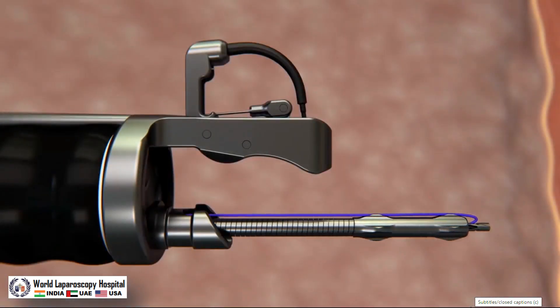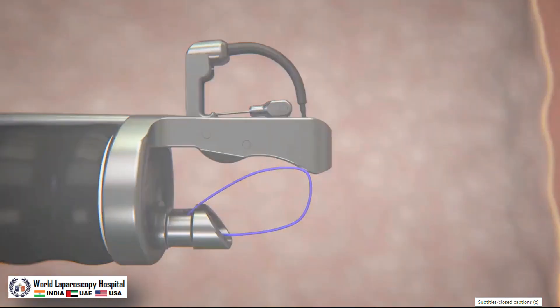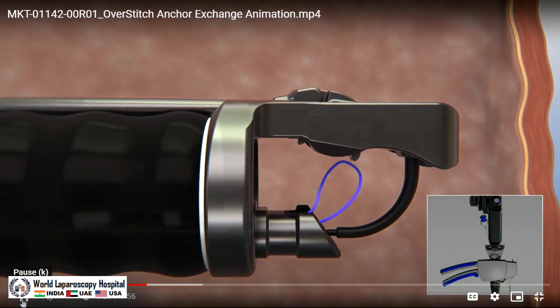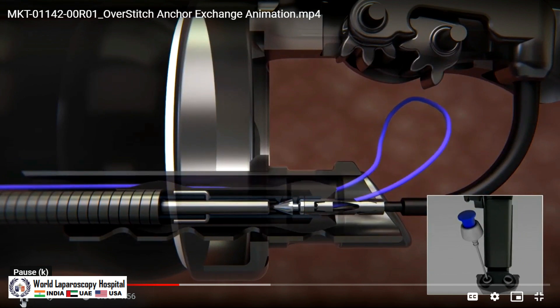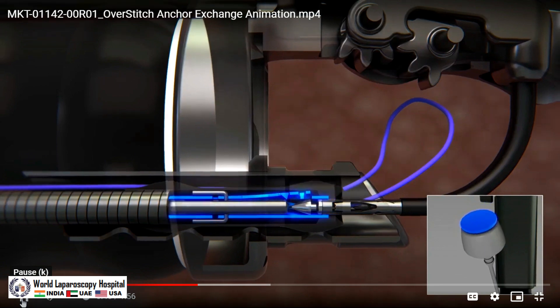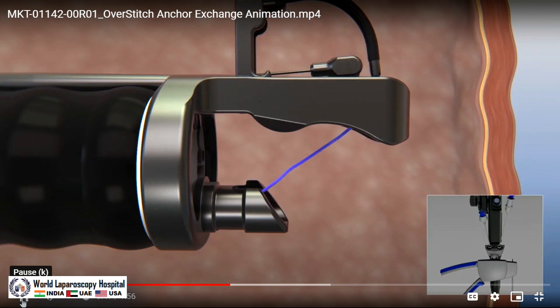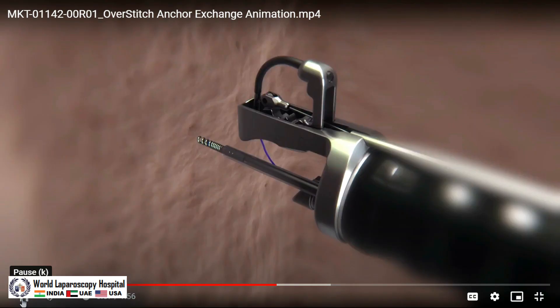Insert the anchor exchange with the anchor through the 3.7mm scope channel. Create suture slack by extending the anchor exchange past the end cap, then draw back. Prepare to load the anchor by closing the OverStitch handle. Advance the anchor exchange until the anchor clicks onto the needle driver and will not advance further. Press the blue button on the anchor exchange and pull back approximately one centimeter to disengage from the anchor. Open the OverStitch handle. Advance the tissue helix through the 2.8mm scope channel, push the blue cross button to expose the helix, and advance the helix to target the appropriate tissue. Using forward pressure, turn the tissue helix knob in the clockwise direction to capture tissue.